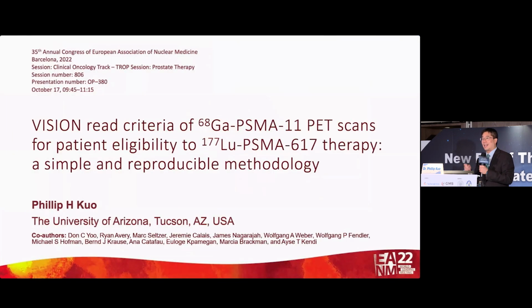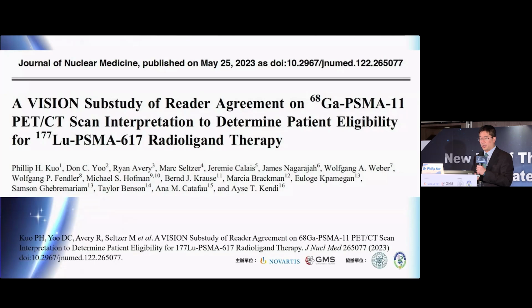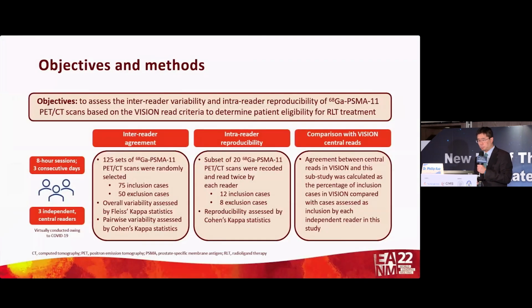Now, an FDA mandated sub-study was, hey, these VISION criteria by PSMA PET have never been used before. If we're going to prove this, people need to be able to do this in the real world. So we did an inter-reader agreement study as well as reproducibility study, as we do for many of our diagnostic studies as well. And this has already been published, but I'm going to show you some slides that we presented at EANM. We took 125 of these scans.